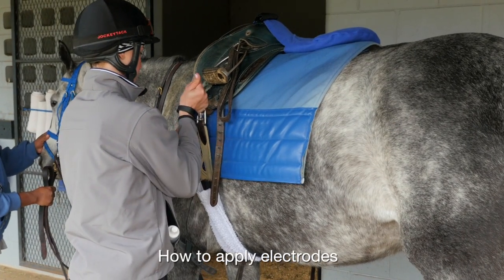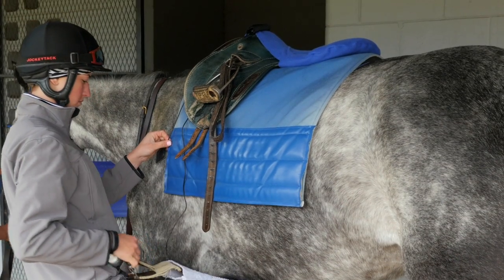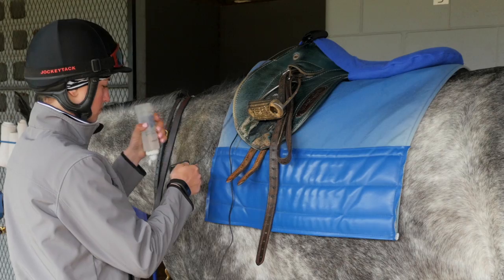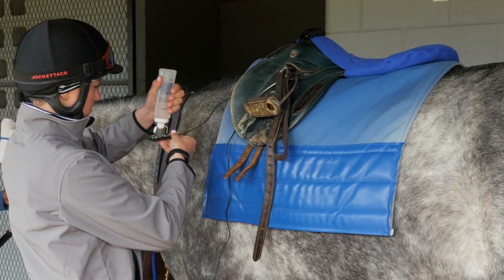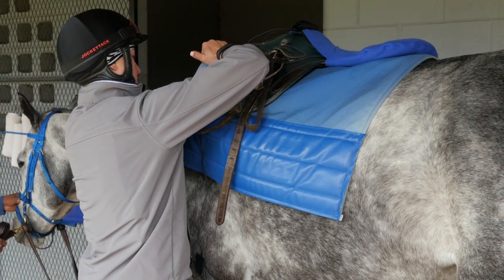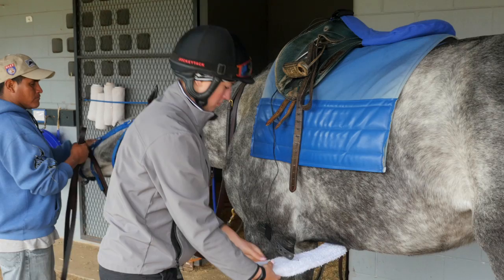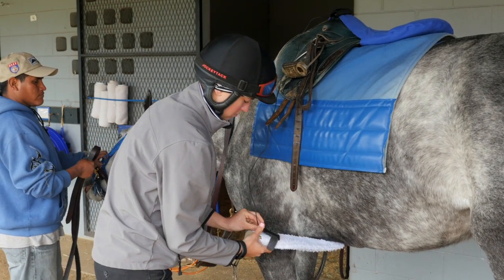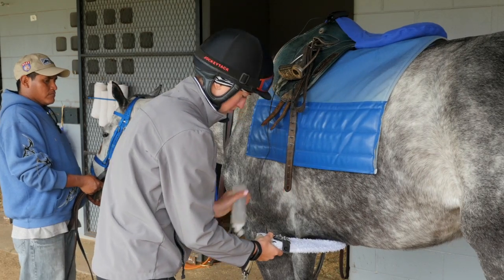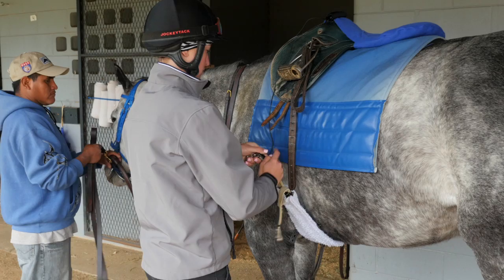Here we have the heart monitor already on the saddle. Emma is going to undo the girth and take the shorter electrode on top. She'll put a good amount of electrode gel on it to keep contact with the saddle, and then, lifting the saddle, she'll put the electrode way underneath, under the top part of the saddle. The longer strap has a little rubber bit around it that connects to the girth. Again, she'll put the ultrasound gel on and connect it to the horse.